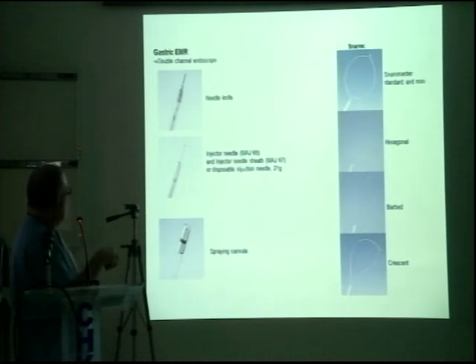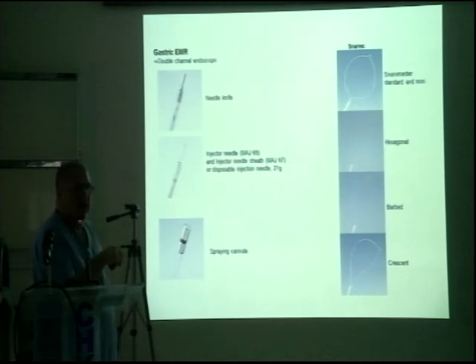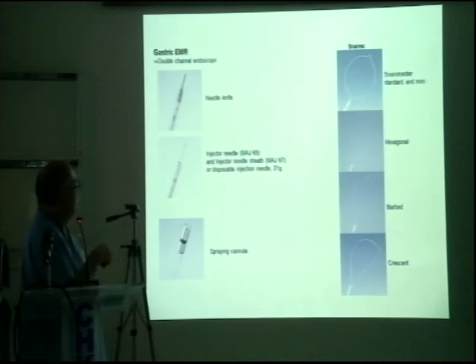Injector needles: 21 gauge, 23 gauge, 25 gauge. Do we know what we're talking about? The narrower the needle, when we inject the solution underneath, the smaller the hole it leaves. Should you then use gelofusine or saline, it will seep out of that area that you've done.